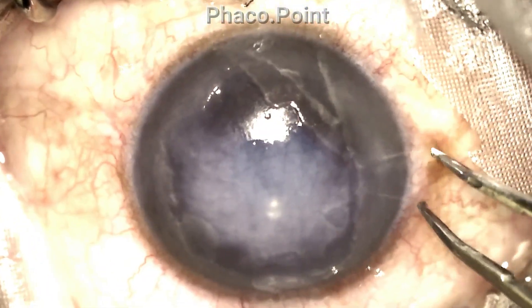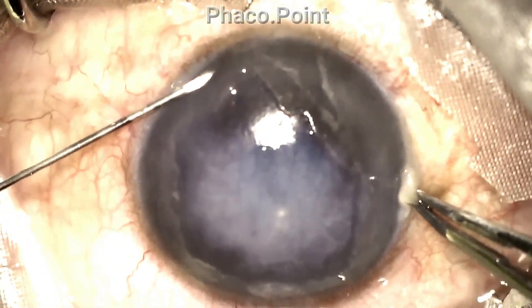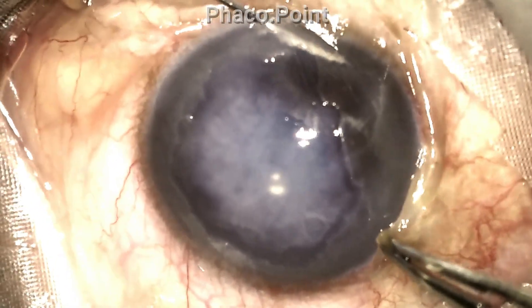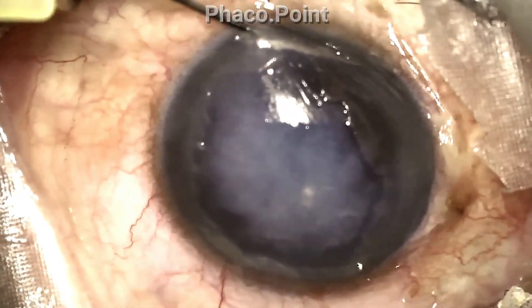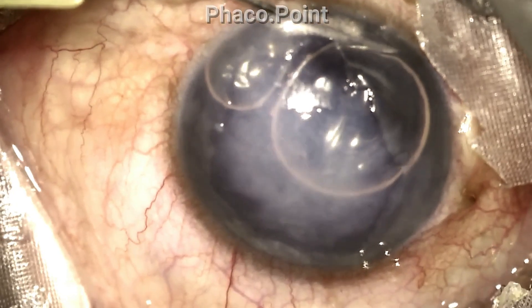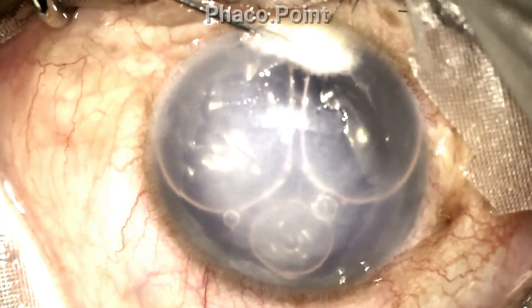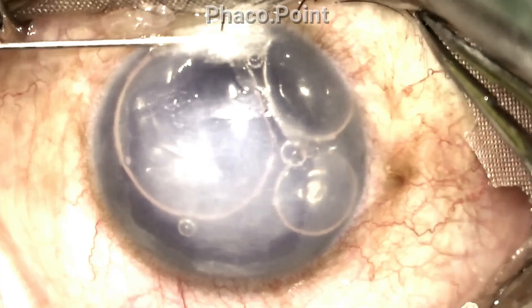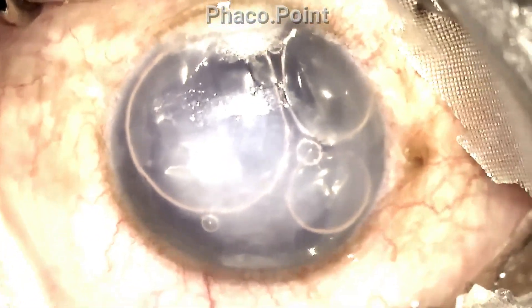The globe is stabilised with the help of a fine-toothed forceps, and the 30-gauge needle now traverses a certain distance — almost a few millimetres — within the cornea, and then dips inwards, after which the gas or air is injected. The needle then works its way back through the track initially created, resulting in a well-sealed port of entry.